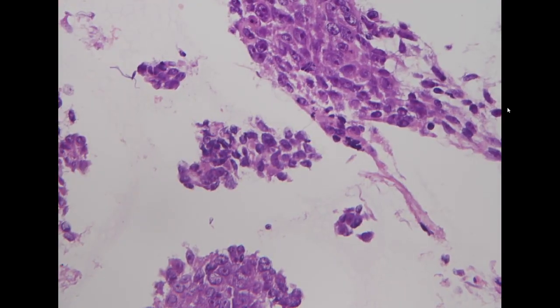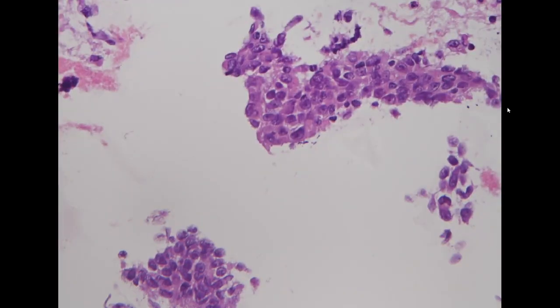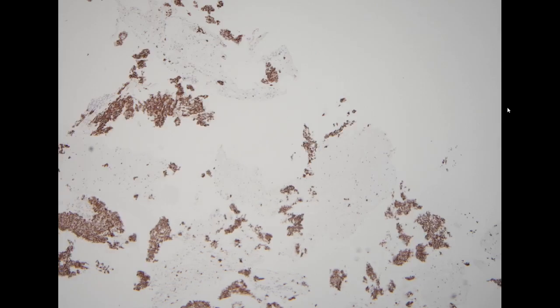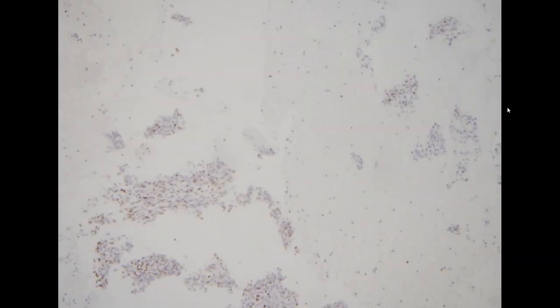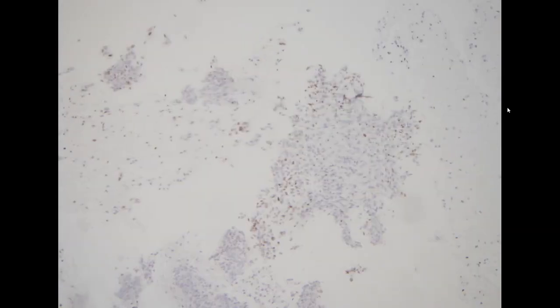First of all, we want to demonstrate the differentiation of the cells. Our first consideration is if it is a carcinoma, so CK is positive. If it is a ductal epithelium or myoepithelial element, GATA3 for ductal is only focally positive, mostly negative.